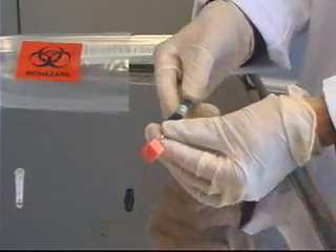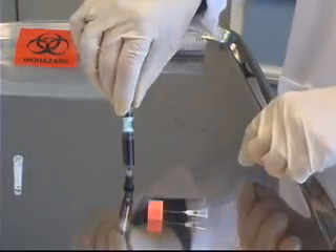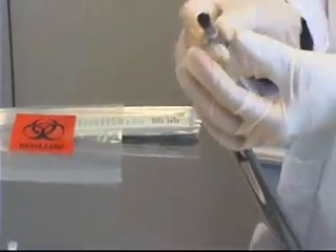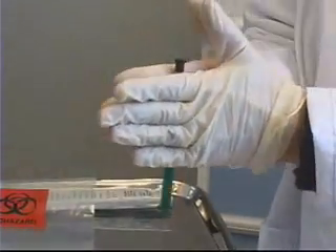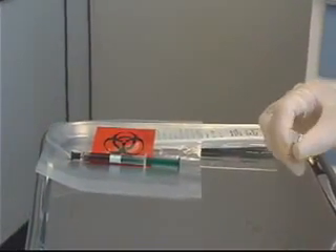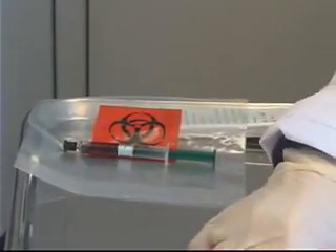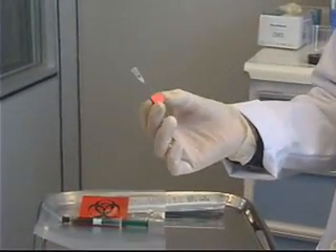I can now remove the cube and needle together, and attach the black cap to the tip of my syringe. I give it a roll to make sure the heparin has dissolved, and then place it into the bag of ice to send off to the lab. My last step is to dispose of the needle and cube in the proper sharps container.